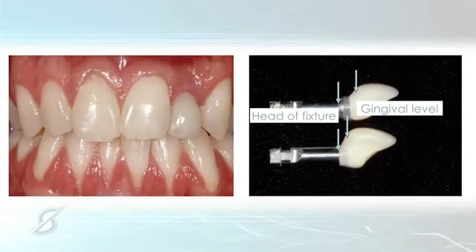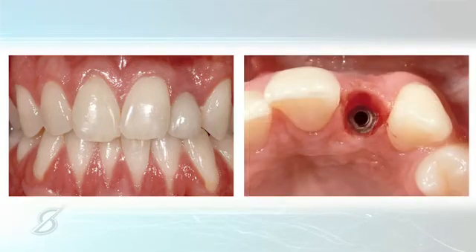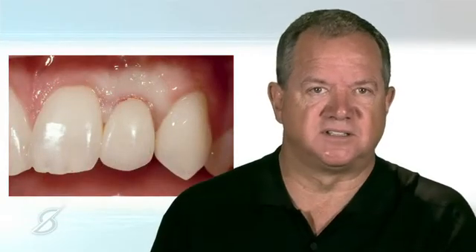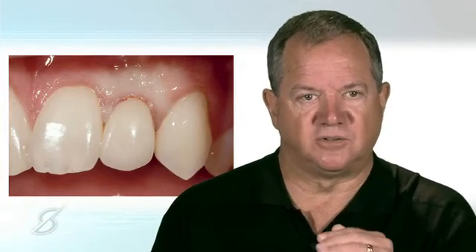So here he is. He's now back, ready for me to remove his crown and put my temporary in. The tissue looks much happier because we closed that gap off by filling composite in there. And here is my temporary seated in place. You'll notice the blanching, but you'll also notice the gingiva moved apically almost perfectly, almost immediately.